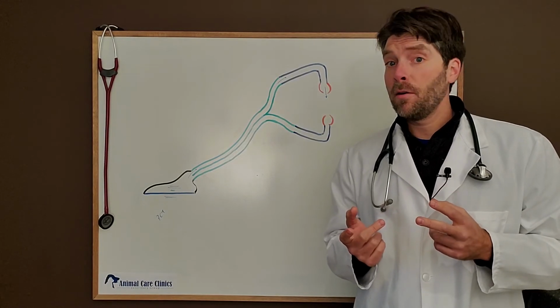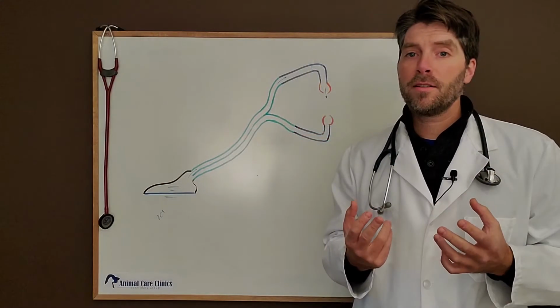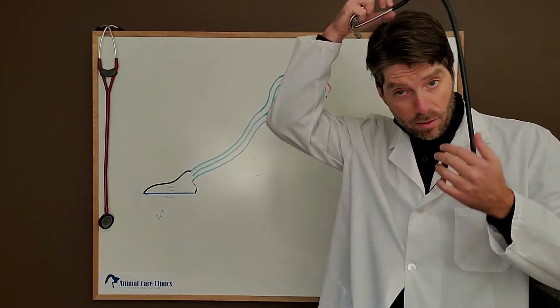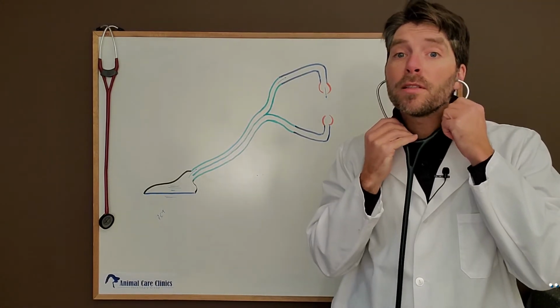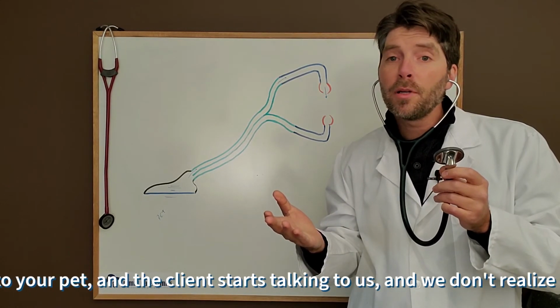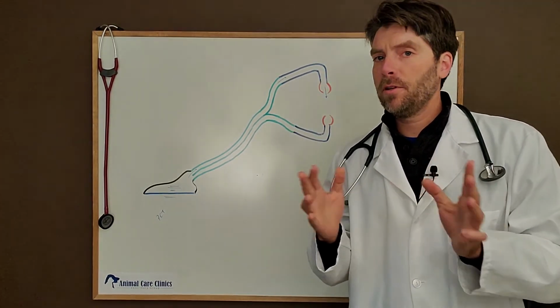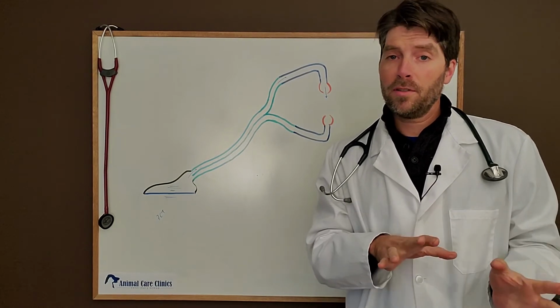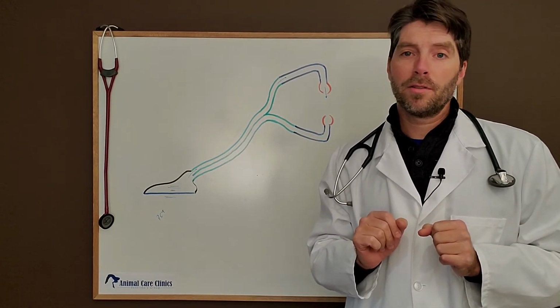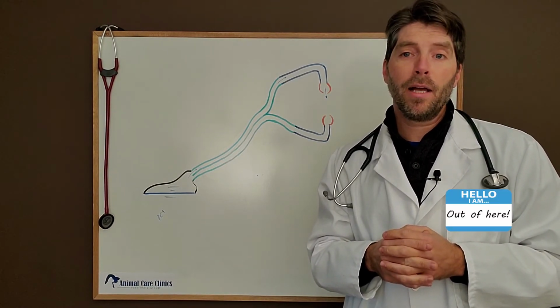The other thing that we can hear a lot is the rest of the world. So if we're in a noisy environment, it makes it really hard for us to hear your pet. Of course, the flip side to that is sometimes we poke the earpieces in our ears and we're listening to your pet, and a client starts talking to us and we don't realize because we can't hear them, because the earpieces actually seal out sound pretty well, but loud noises get in and interfere. So just so you know, if we're listening to your pet with a stethoscope and you say something to us and we're very rude and ignoring you, we're probably just not able to hear you. So wait until the stethoscope's out of our ears. And if we're still ignoring you, then, well, maybe that's telling you something.